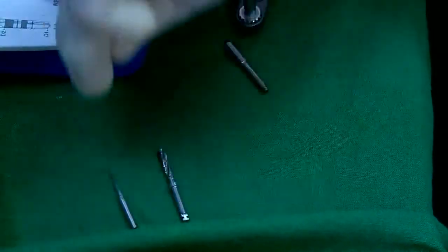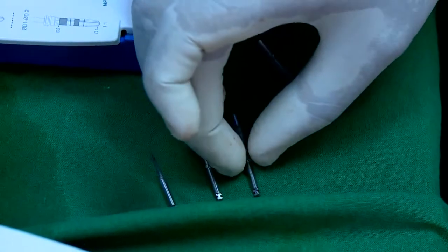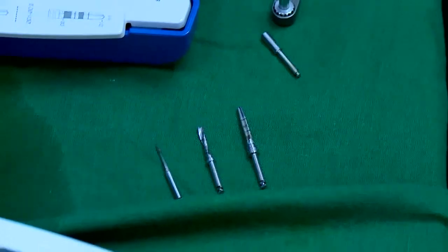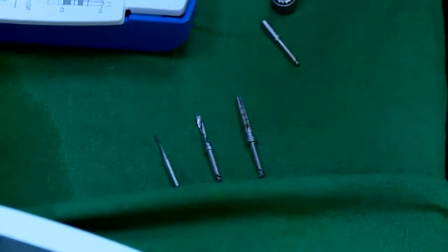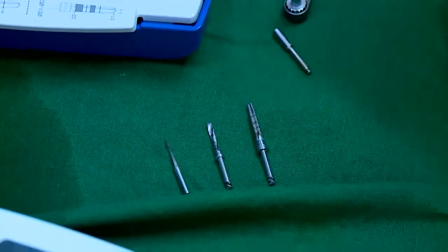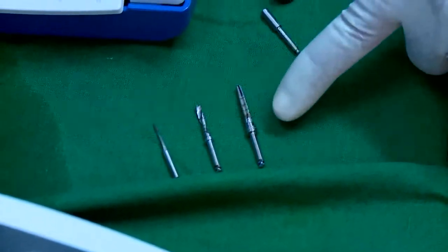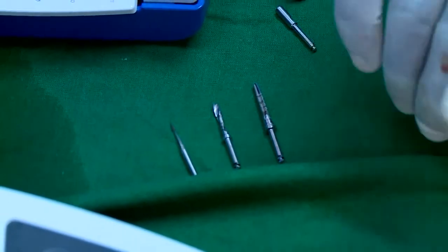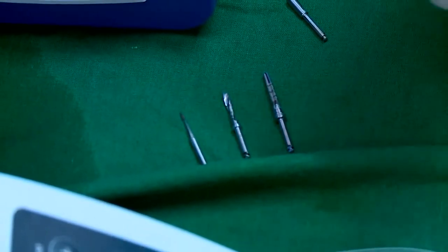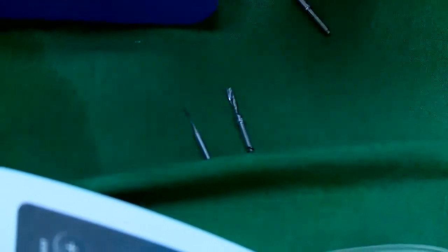My second drill is a straight drill, but from my third drill onwards, this is a tapered drill. When this one says 2.1, 3.1, it tapers from 2.1 to 3.1. So on the tip it has a 2.1 diameter, and on the crest it has a 3.1 diameter. You always do one step, and you can under drill it, particularly depending upon the type of bone you are looking at. So I am going to use my first taper drill right now.